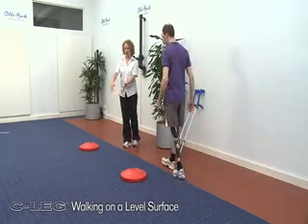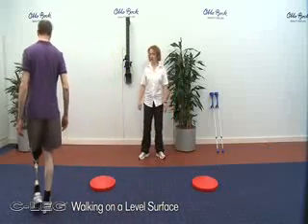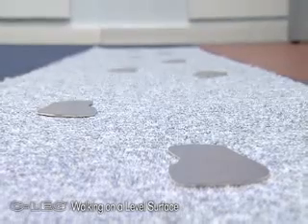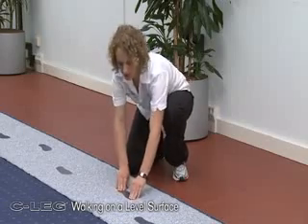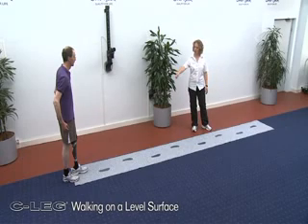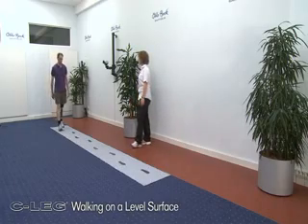In order to raise the level of difficulty, the patient should walk in a circle or a figure of 8 while initiating the swing phase on the outside and on the inside of a turn respectively. In order to develop a physiological stride length and stride width, and therefore a more harmonious gait pattern, positioning footprints on the floor with spacing adapted to the amputee is recommended.